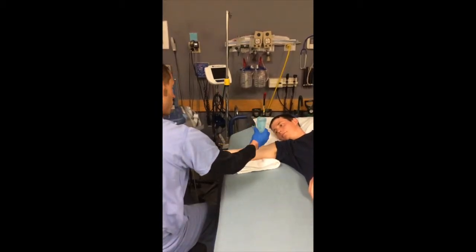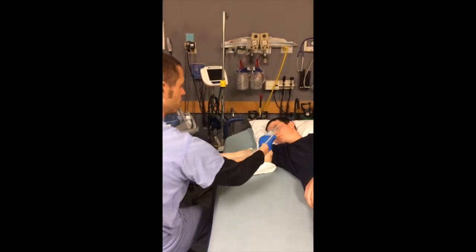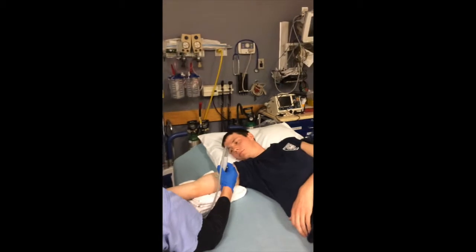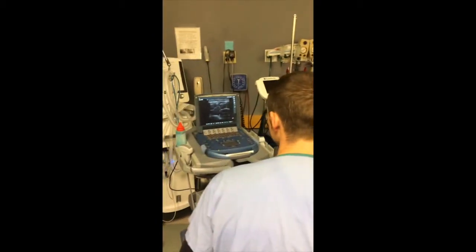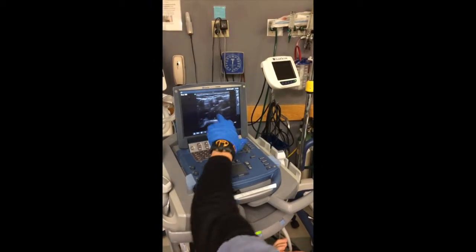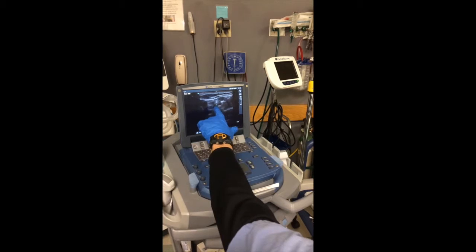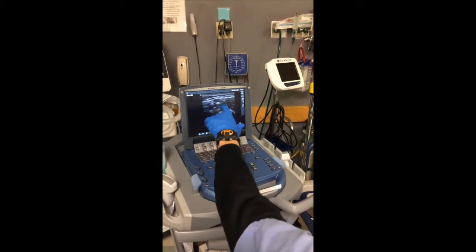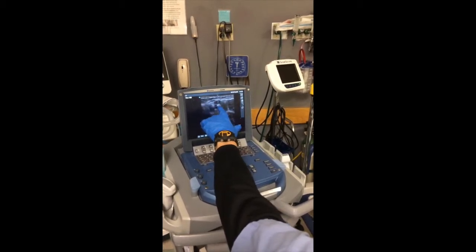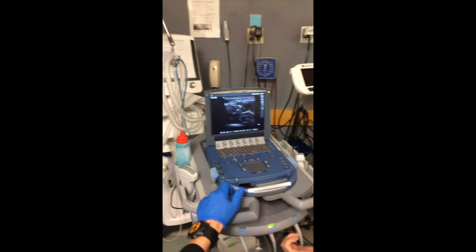So when you first just do an inspection, I just use regular ultrasound gel — this is purely just to look. Get a nice C-grip, use your pinky finger on the base of the arm. I start right in the middle and the first thing I look for on the monitor is the brachial complex. If I compress down, right here is the artery — you can see it pulsating. When I loosen up, just laterally is the basilic vein. You can see it compresses beautifully. Just beside it, it looks like there's a little nerve running along it. So that vein looks pretty good as a target.